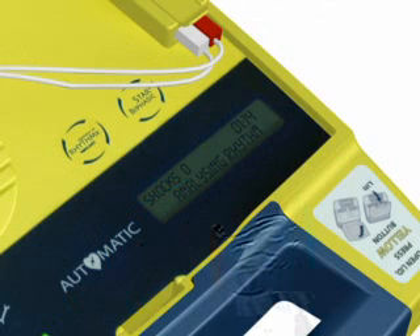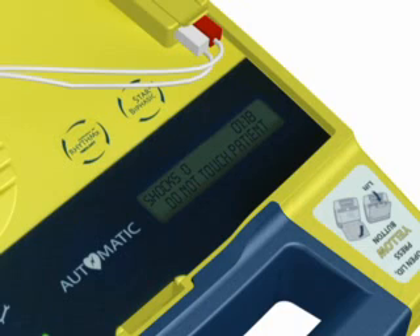Do not touch the patient — analyzing heart rhythm. Please wait. Do not touch the patient — analyzing heart rhythm. Please wait.